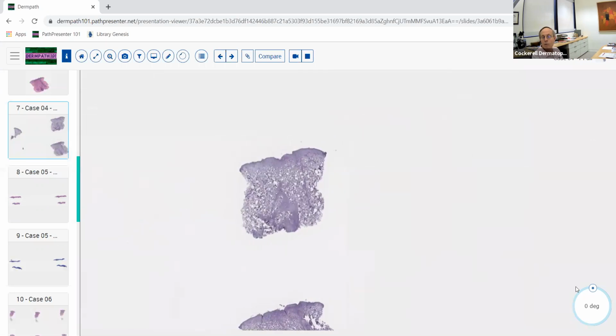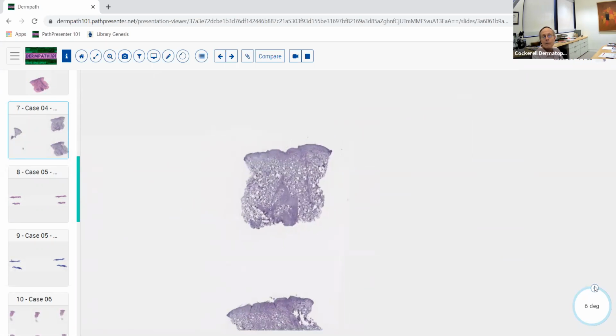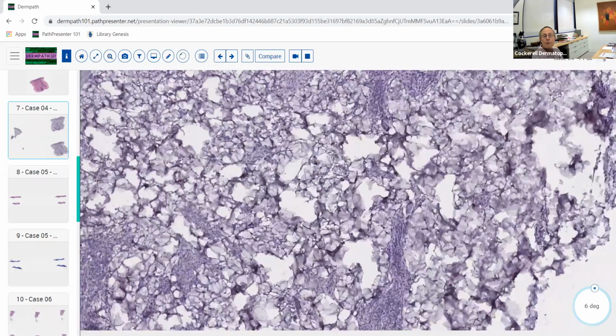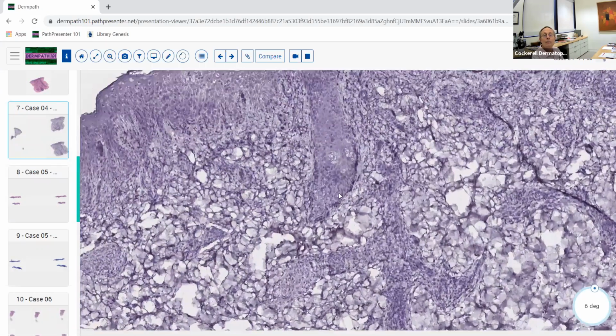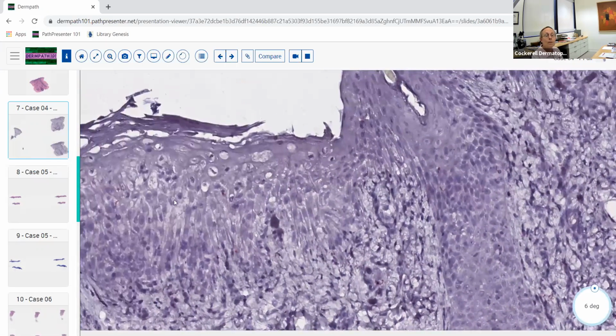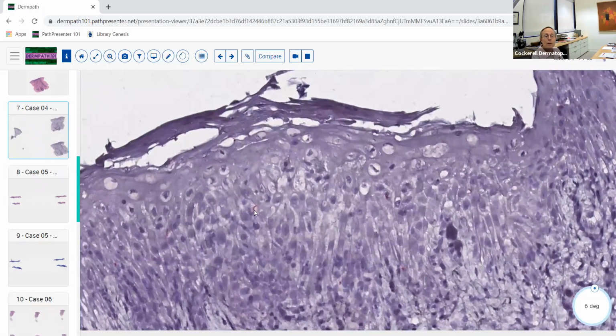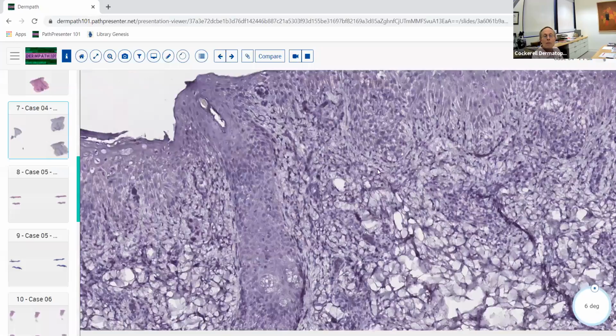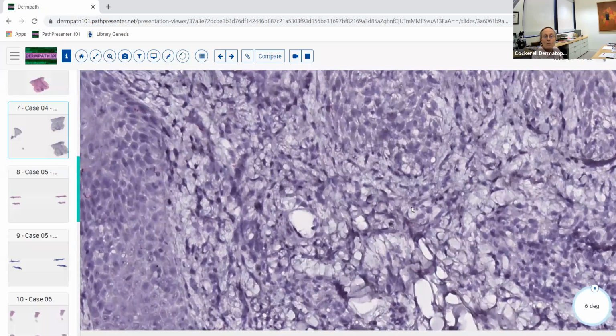I happen to have one right here of this case, and it was loaded in this case with abundant spirochetes. Now there's several places to look. The best place to look is in the epidermis. That's the most common location for spirochetes. Here you see some right over here. There's a bunch, okay? But sometimes they actually are present in the granulomatous infiltrate in the dermis. So you have to look in here also.